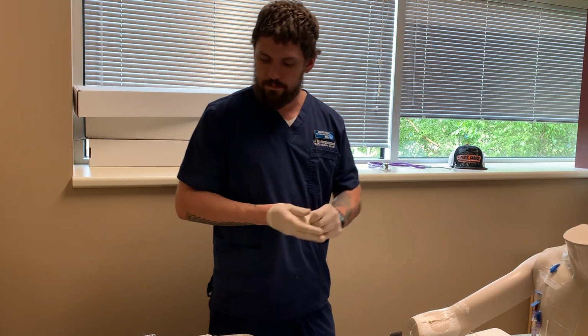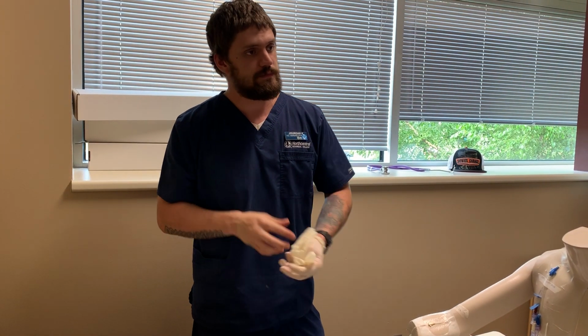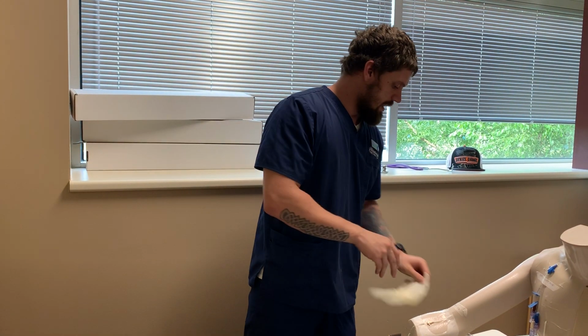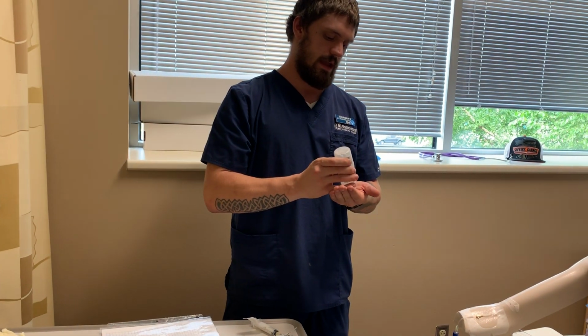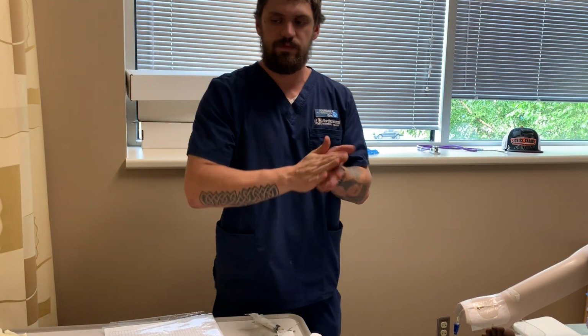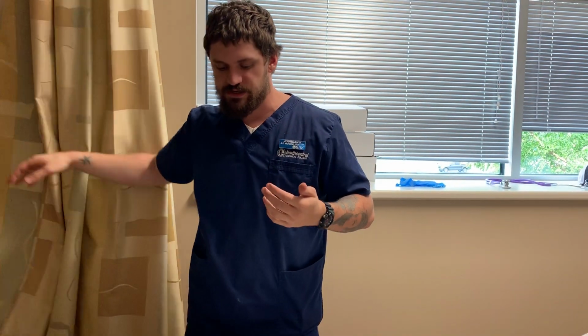We will get rid of our supplies, remove our gloves, wash our hands, and we will unprovide privacy. And we will make sure to document the time, date, assessment findings, as well as the drug administration, the amount, where it was administered, the reaction, how it was handled, and anything else that goes along with that. And that is how you administer an IV push medication through a central line.